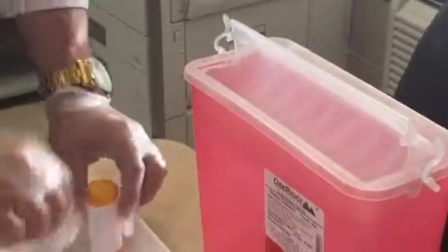Don't recap the needle, and place the syringe in the hard container for disposal.